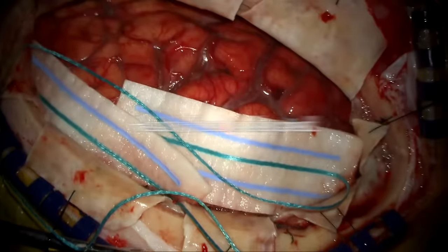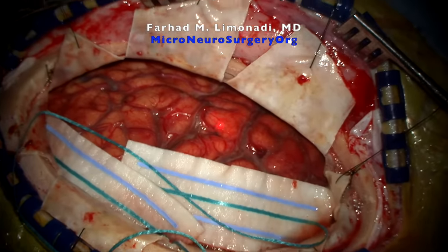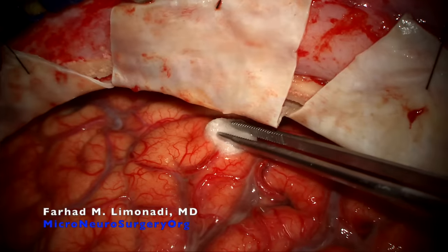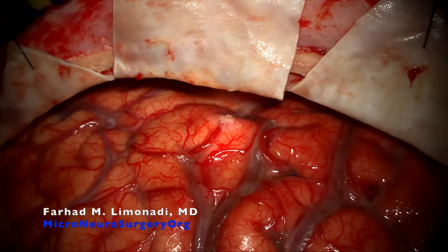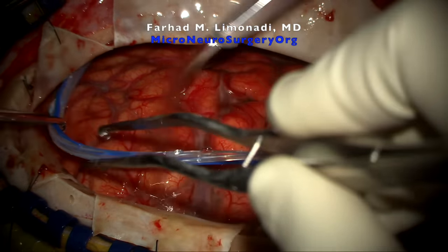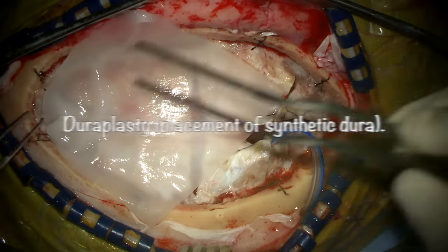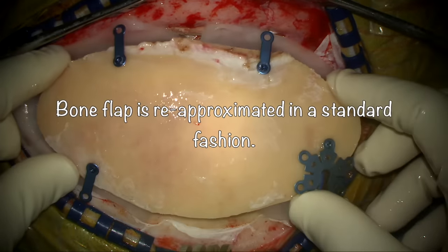Head of the bed is brought back up again. Papaverine-soaked gel foam is placed over the repaired cortical artery to prevent vasospasm and injury to sensory motor cortex. A drain is then gently placed in dependent area of subdural space. Bone flap is reapproximated in a standard fashion.